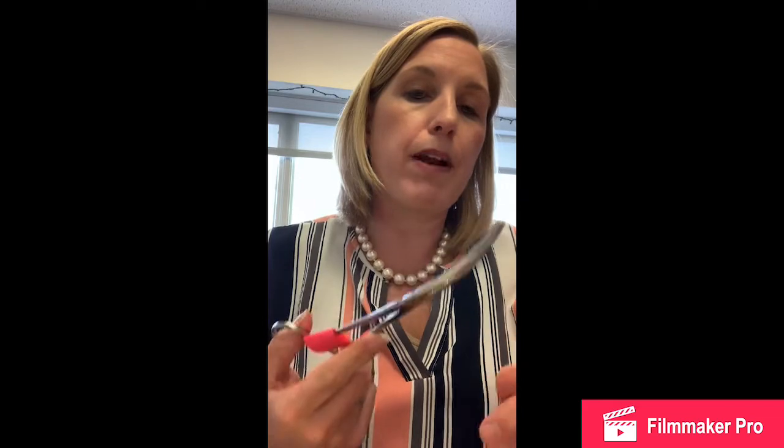So you're pulling the fascia and hopefully the peritoneum up away from any bowel underneath. If you're going to try to poke through the peritoneum, you should use something that's very blunt, like a Kelly, to poke through. You won't want to use something that is very pokey that would go through a bowel rather than push it away. So we use a blunt tip instrument. If instead I don't want to push the peritoneum away and I want to just grab the peritoneum and pull it up and get in by using scissors and incising, I would use the Crile or the tonsil to pull up on the peritoneum, because it is very directed and very pointy. So Crile is pointy, Kelly is not pointy.